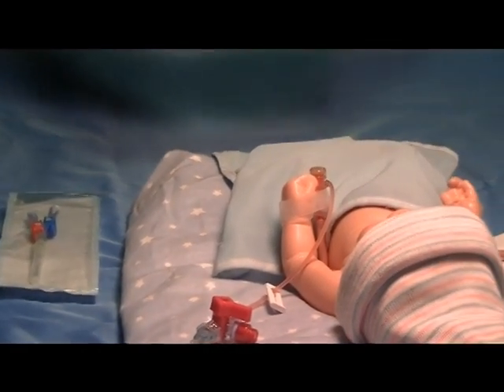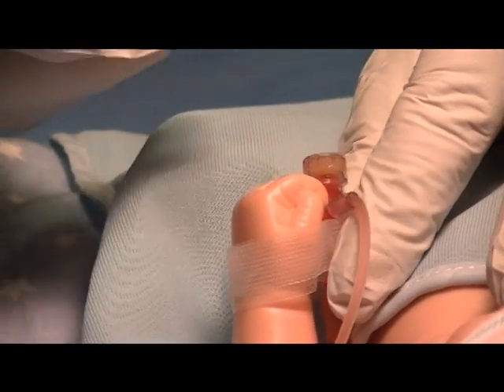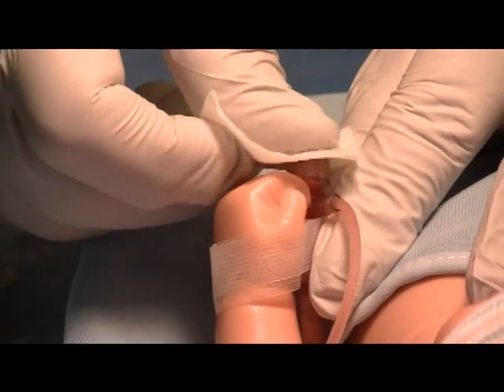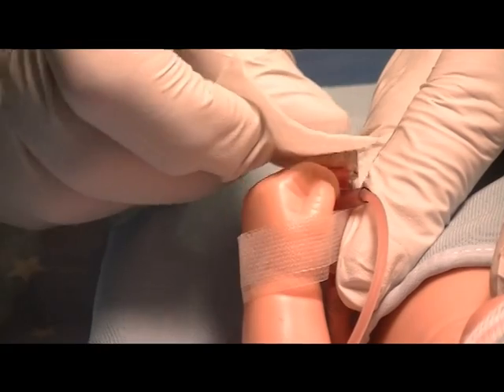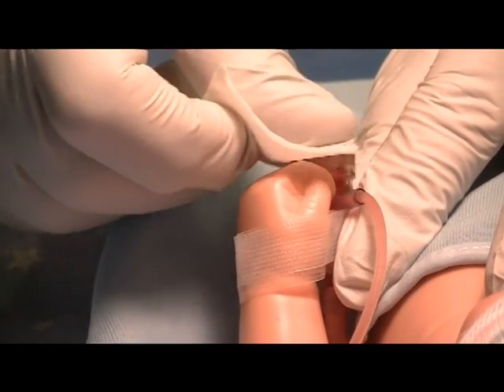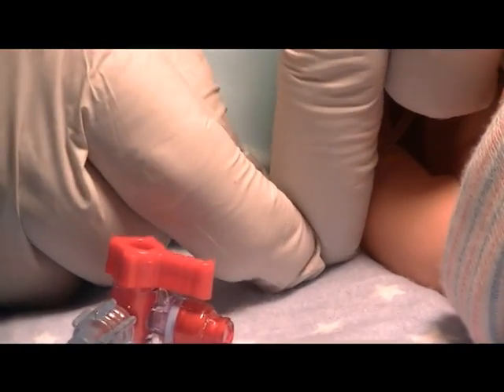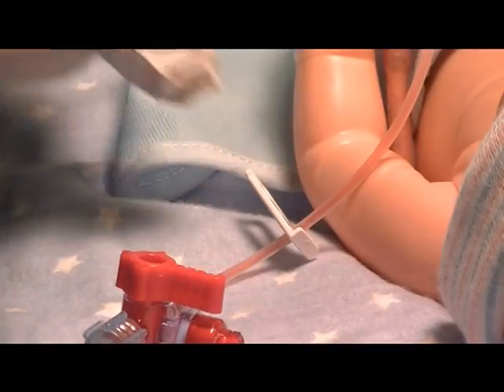You would initially prep the T-connector according to your hospital policy and clamp the T-connector to prevent flow from the arterial line.